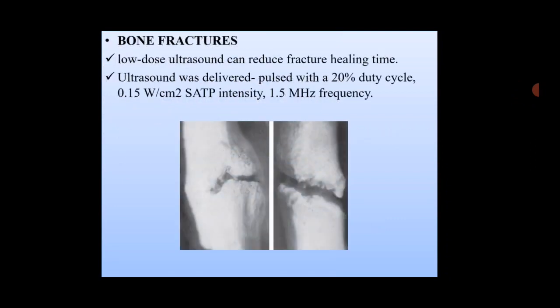Then coming to the bone fracture. Whenever you are giving ultrasound for a bone fracture, you should be very cautious because if you give a high dose of ultrasound, it will increase the pain. But if you give a low dose of ultrasound, studies have shown it will reduce the fracture healing time. For that, you should select ultrasound parameters of low frequency, that is 1.5 megahertz frequency.